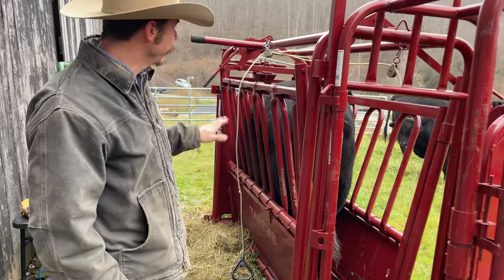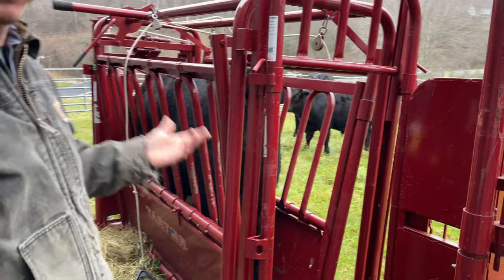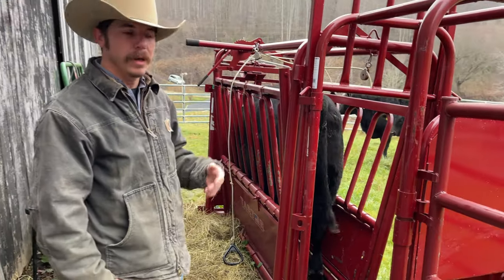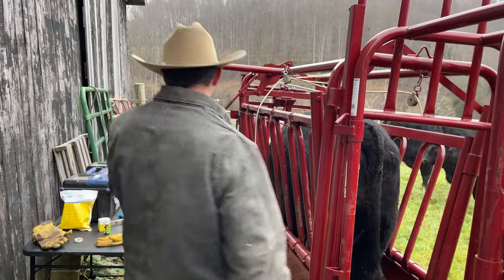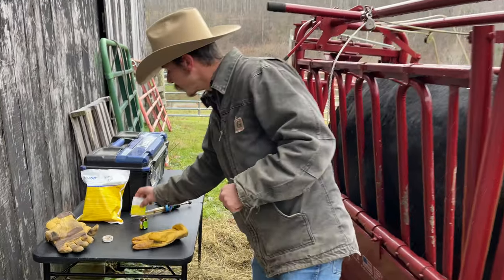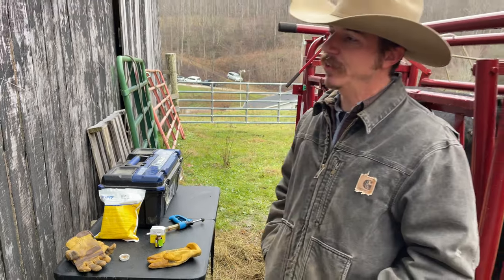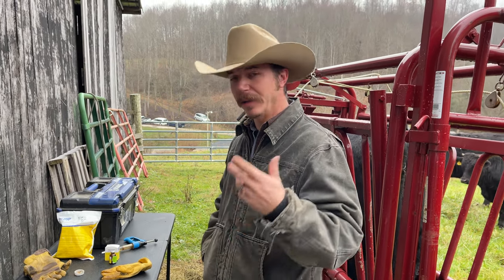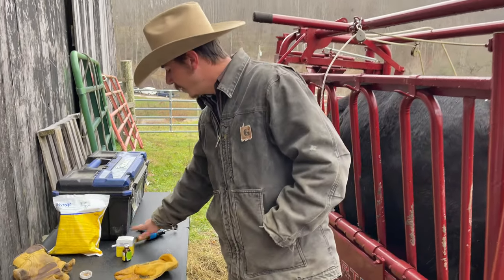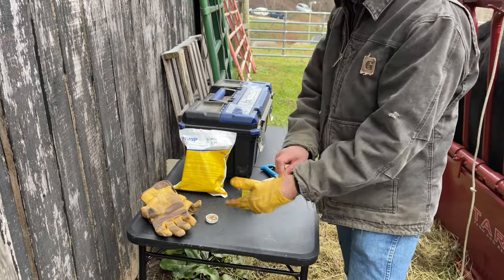Today we're setting up some cows for artificial insemination. We're going through the protocol to get them ready. What we do is take a shot of GnRH — two cc's — which is essentially a luteinizing hormone. It causes them to get ready to breed, get them in the mood. So we're going to give them a shot of GnRH and put a CIDR in.